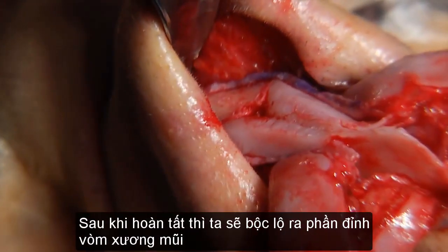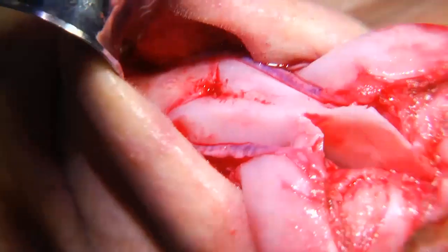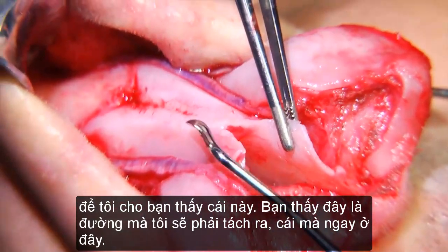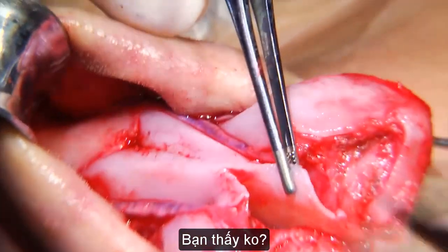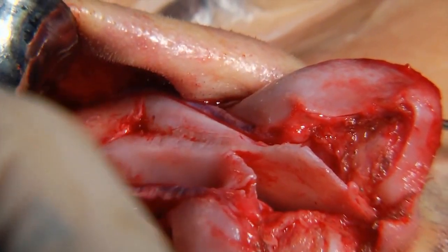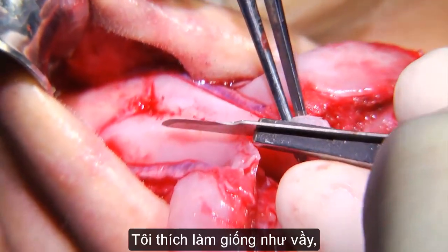Having done this, we have the keystone exposed. So before I actually split the components, let me show you this. You can see the line where I will have to split it, which is here. Can you see it? It's not here. If I go flush to the septum, give me the blade, the 15. If I go flush to the septum, I will actually use a different path. I have to go like so.